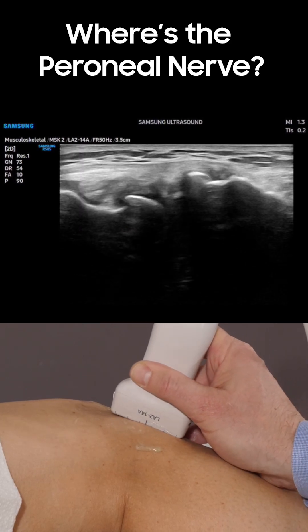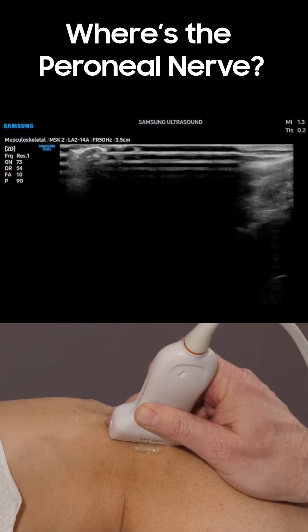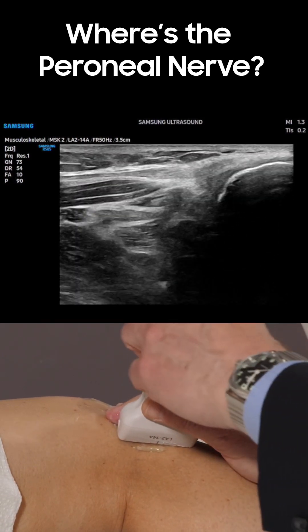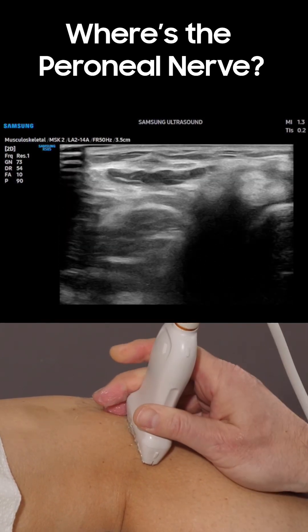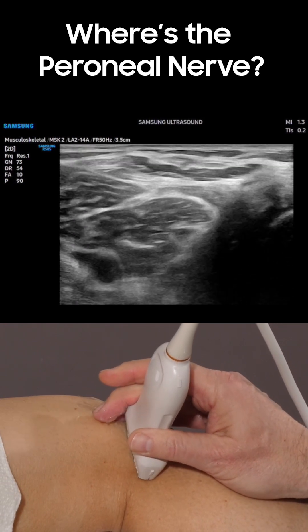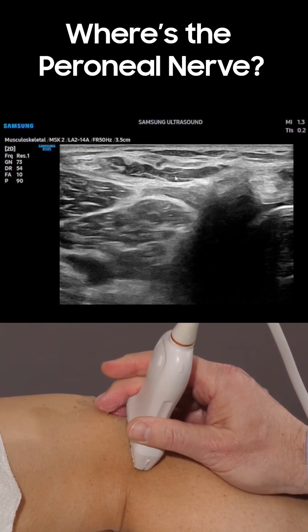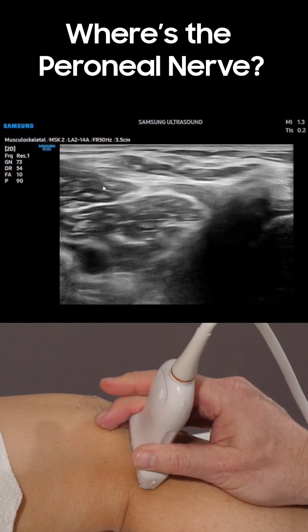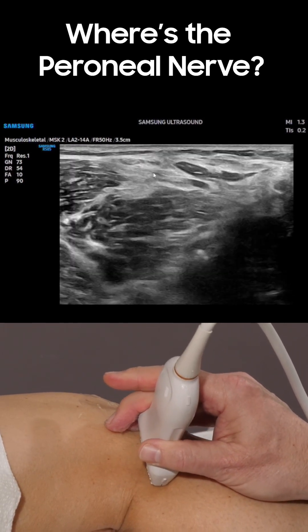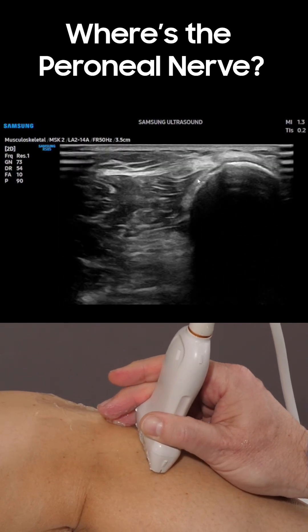I'll finish by looking at the common peroneal nerve. Coming back to the biceps femoris, if I turn short axis to the structure, anterior will be on the right. What we see here is the tendon and muscle of the biceps femoris. Directly posterior to that is where we'll see the common peroneal nerve. Then we track that distally as needed — it will go around the fibular neck.